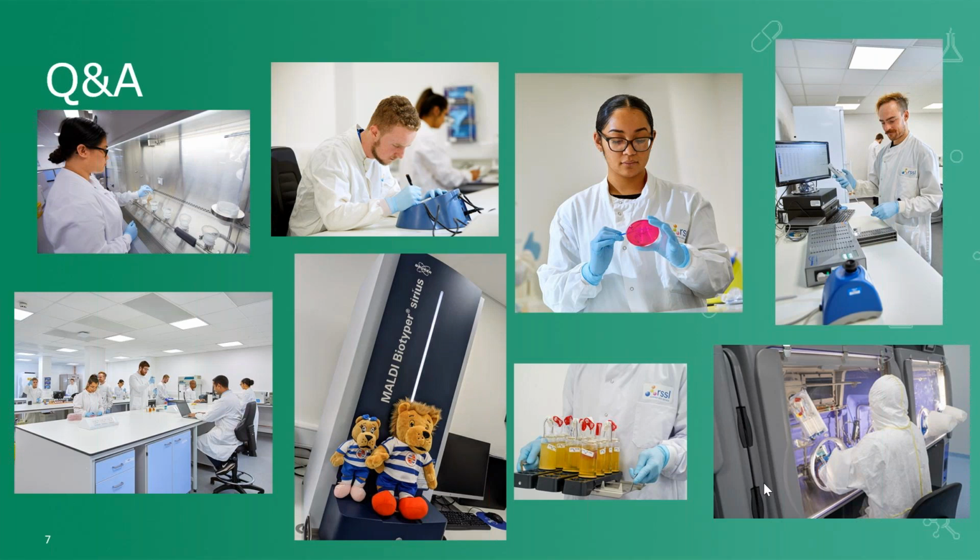So according to chapter 5.1.6 of the European Pharmacopoeia, a compendial method can be replaced by a rapid microbiological method, provided that equivalence or better can be shown. So if you can run the rapid method and the culture-based method in parallel and show equivalency, then it is suitable to do that, typically through a license change application.